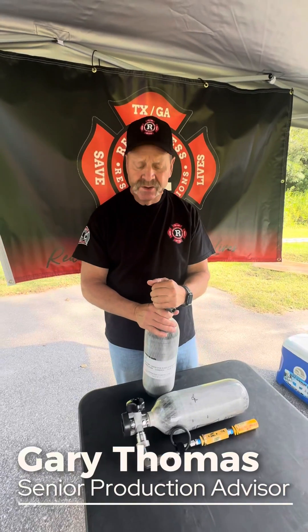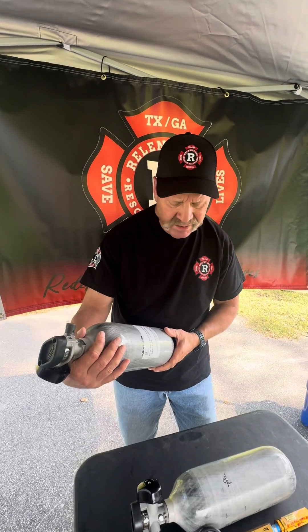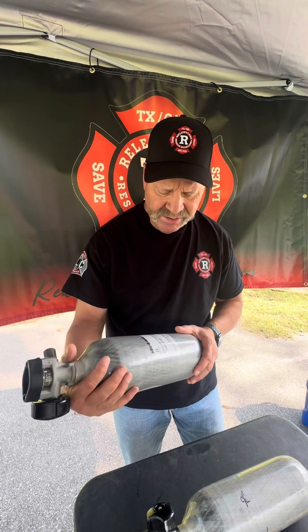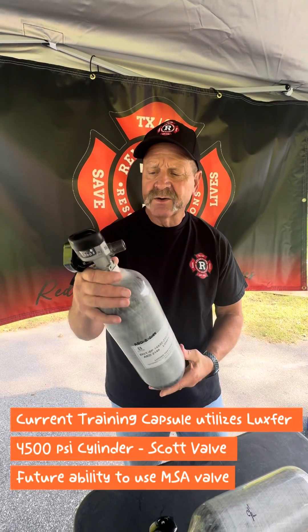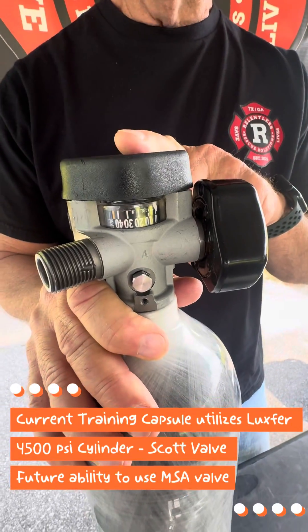Hello, this is Gary with Wellness Rescue Solutions. We just want to go over a brief description of the bottles and the air systems for the TLC. We're going to be using a Luxfer 4500 PSI cylinder. We've also got a Scott SCBA valve. This will be typical in all of the systems.